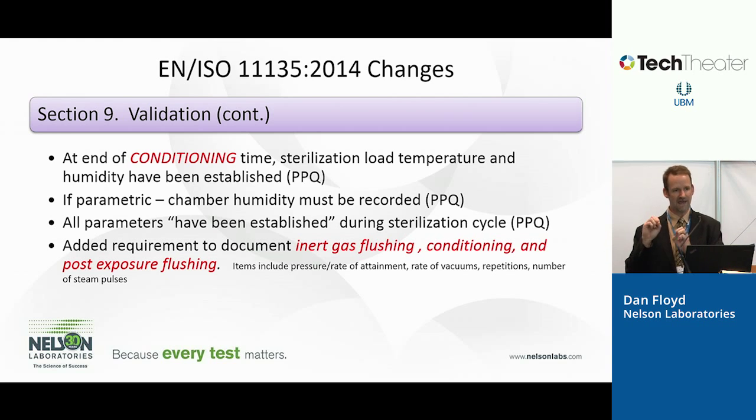So conditioning is where they add steam, which also brings back the heat and humidity into that load. That's allowed to sit for a little bit of time, usually like 60 minutes is pretty common, and then the gas is added there. But some cycles only use conditioning. They don't use outside preconditioning. So this change was done to allow that to go through for cycles that use conditioning only.